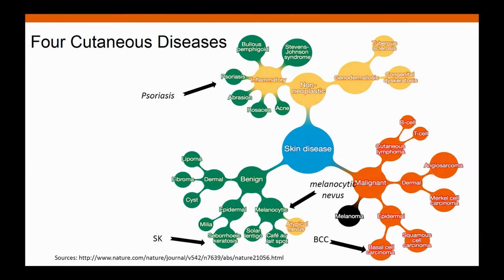The reason we chose those four diseases for our experiments is not only because they're the most commonly seen skin diseases in hospital, but also because they're representatives of the two main binary classification situations. One is the representative for the most commonly seen skin cancer, and the other represents the most studied skin disease.